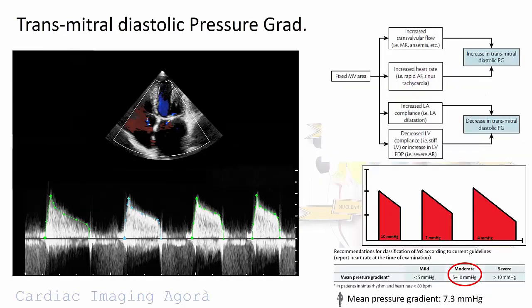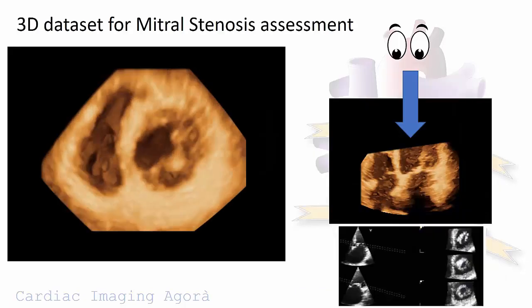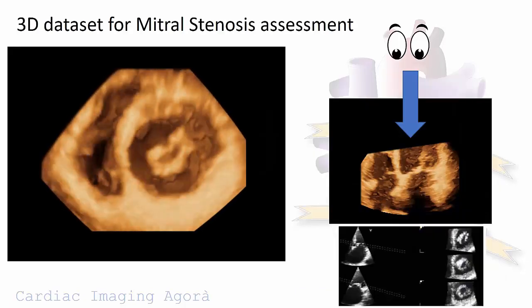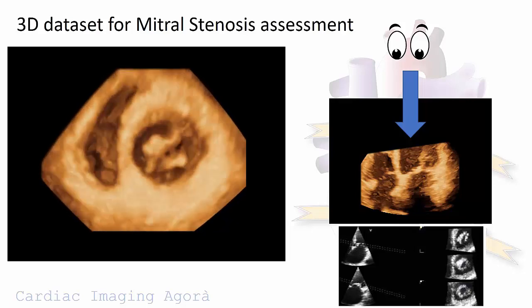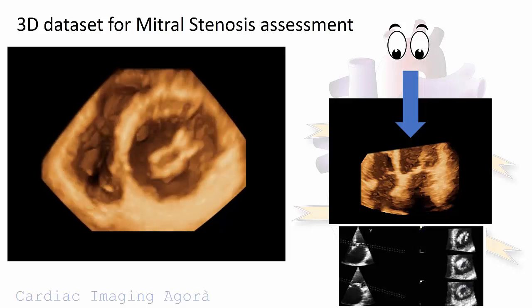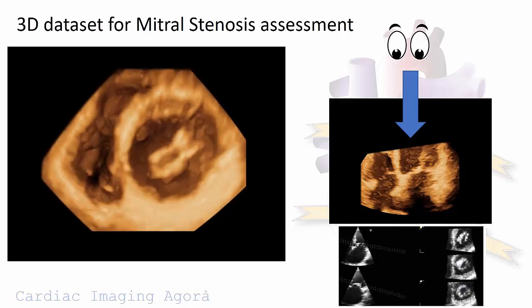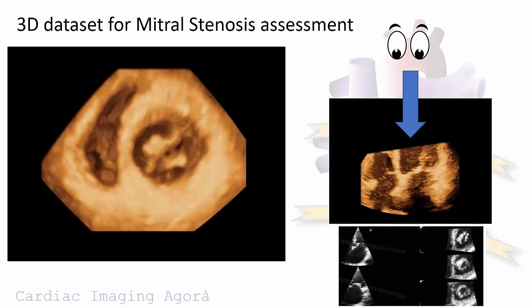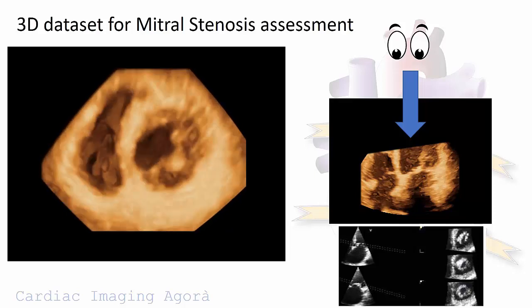Two other elements to evaluate are mean pressure gradient and pulmonary artery pressure. With 3D transthoracic echocardiography, it is possible to calculate the planimetry with the biplane modality, 3D zoom mode, or full volume acquisition focused on the mitral valve.